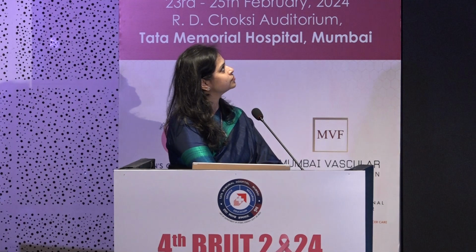So from the home page, I chose Dyna localization and we chose the breast protocol. And this is a standard home page with 4 view images that come on the screen. We first confirm that we have chosen a lateral grid, a 10-gauge needle biopsy, the type of biopsy needle that is going to be used, and the laterality of the breast. So we will choose the left breast.